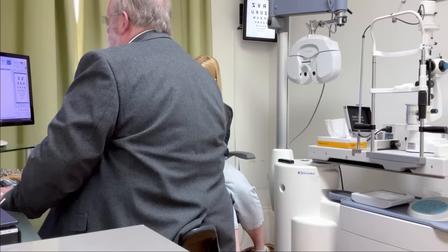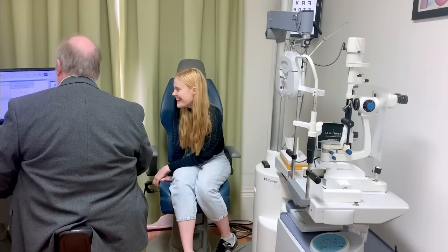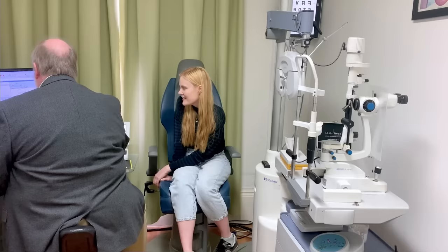So it's around about here. Just a few pigments. I think someone's actually mentioned that to you before. And I was like, what are you on about? So it's a little pigment deposit there, okay?